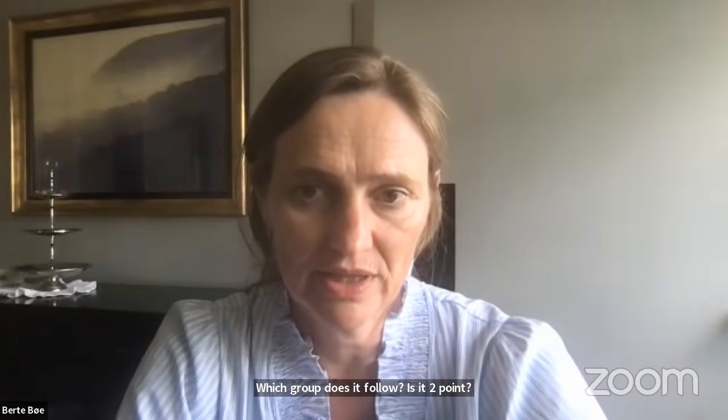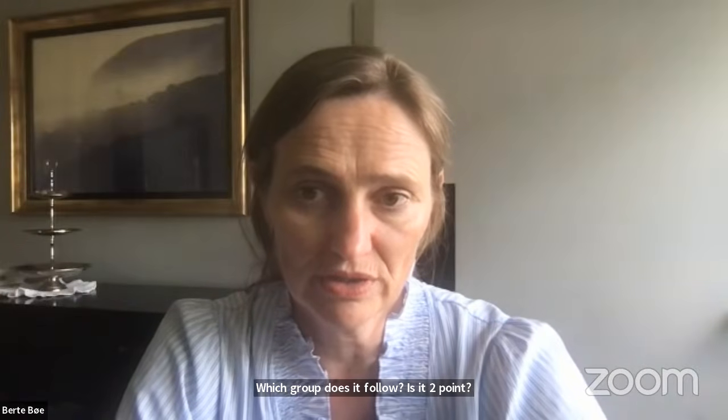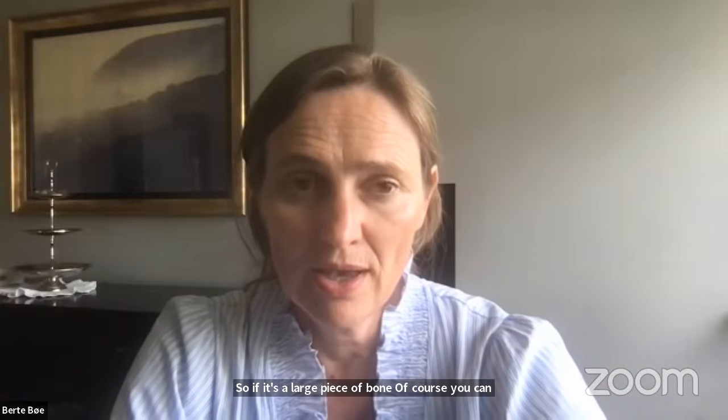And Berte, some authors have described single point versus 2-point fixation, right? So what is your technique? Which group does it follow? Is it 2-point? It is just one tunnel through the bony fragment. There is a guide where you can use 2 tunnels. So if it's a large piece of bone, of course you can use 2 tunnels.